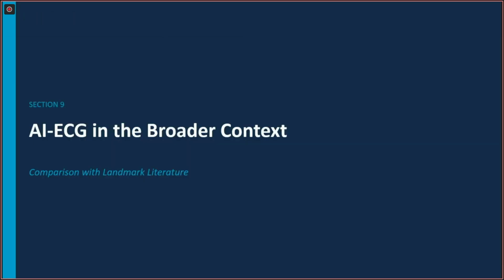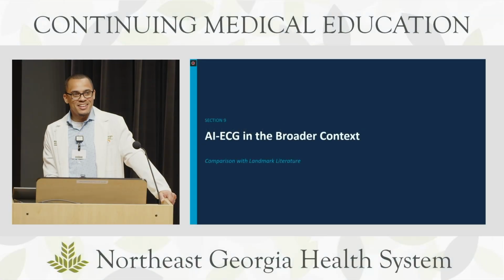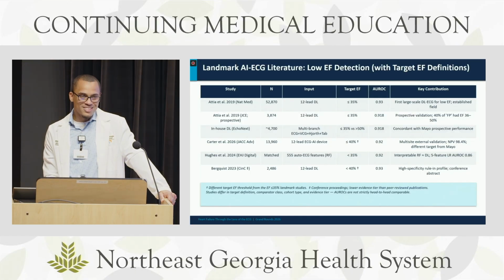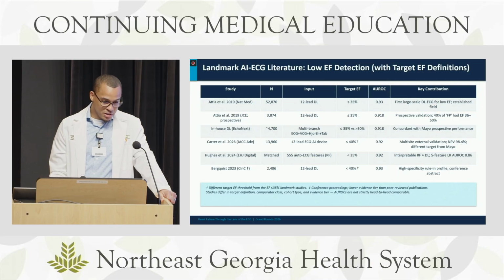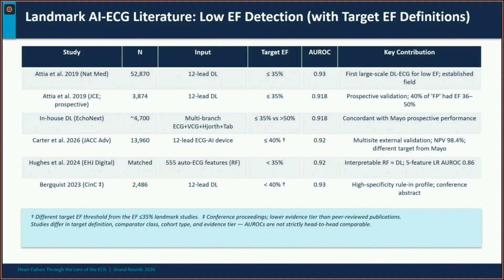So something funny about this. When I first started working on this, I used to walk around puffing up my chest, thinking that I came up with this idea by myself, but then when I started reading around, this problem has been studied before. As a matter of fact, the first model built for this problem was back in 2019, and this model was only using the EKG leads.